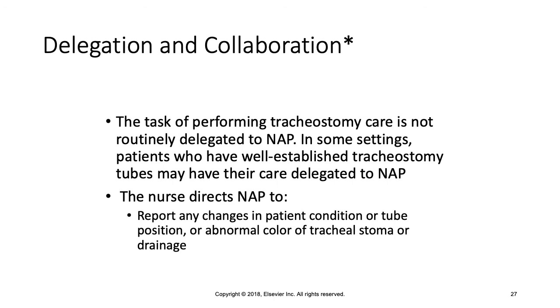Tracheostomy care is not routinely delegated to NAPs. However, be aware that in some settings, patients who have well-established tracheostomy tubes may have their care delegated to NAP. Generally, the NAP will be directed to notify the nurse if there's any change in the patient's condition, if the patient has respiratory distress, changes in vital signs, if the faceplate's not flush with the skin when the NAP goes into the room, or if there's an abnormal color of the stoma or abnormal drainage, color, amount, odor, those types of things. The NAP should report those should they see them or the patient lets them know that they're occurring.